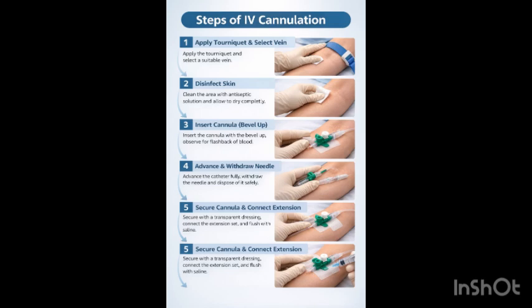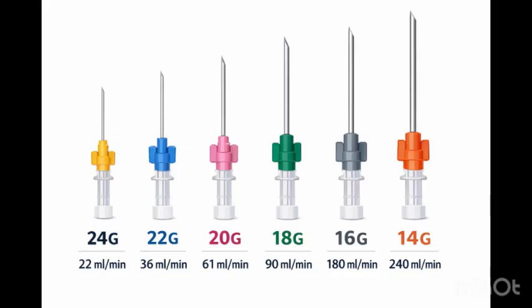And then what are the complications? You can cause pain, distress, you can cause a hematoma, you can cause nerve damage, and you can prick an artery. Then what are the contraindications? You need to avoid it if there's a future AVF patient, and if there is a lymph node dissection which was done earlier.